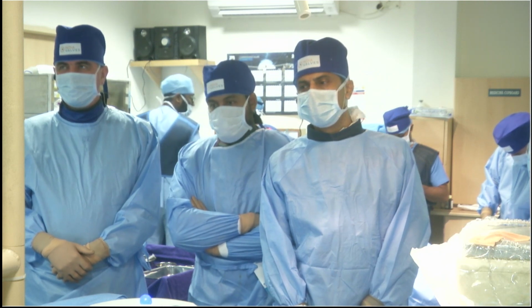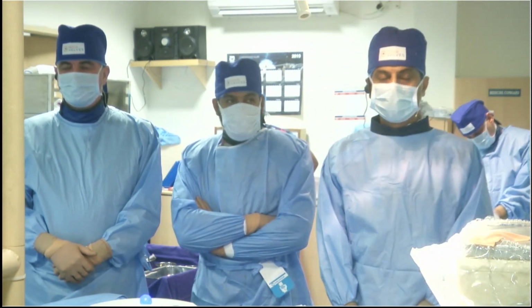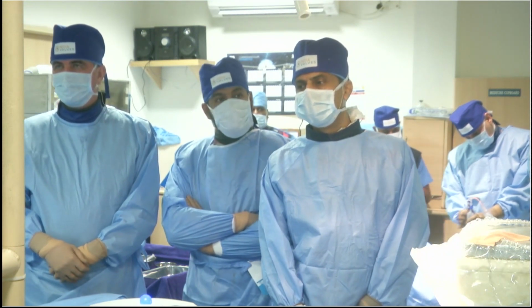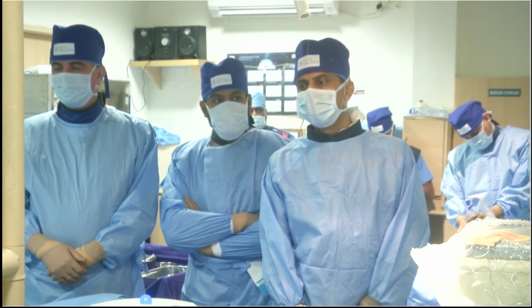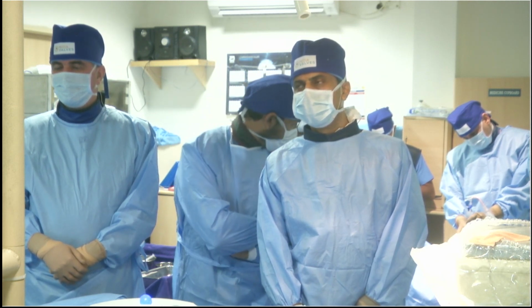So maybe we can start by asking the room, who will go to surgery in this kind of case? Nobody? Please raise your hand if you would like to send the patient to surgery. TAVI? And medical treatment? Okay, so TAVI in the vast majority.